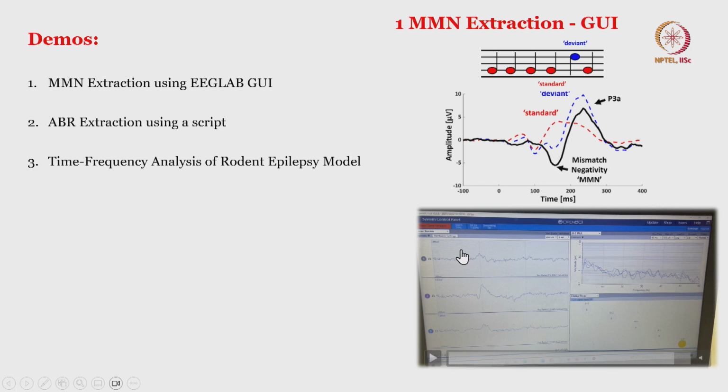While going through the signal processing steps for extraction in MATLAB, I will keep on discussing the experimental protocol as well. But in a nutshell, these 4 standard sounds and 1 deviant, the same pattern, is repeated 100 times to get rid of neural variations. Our brain reacts to sounds, images and touches in different ways, with variable responses. So to avoid the variable response and extract only the neural signal out of it, averaging is performed.